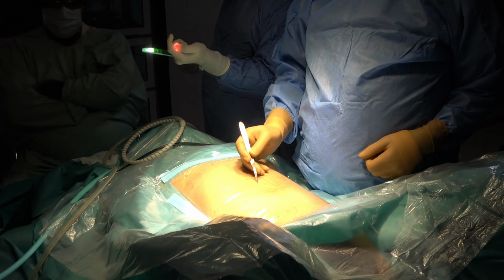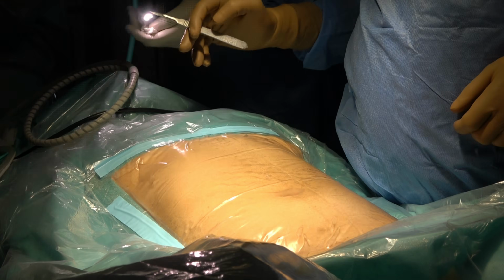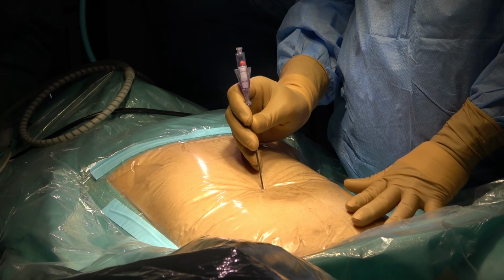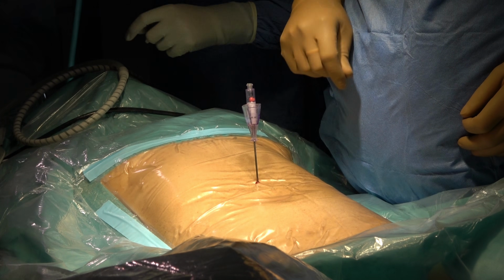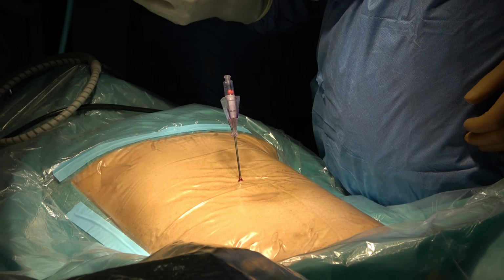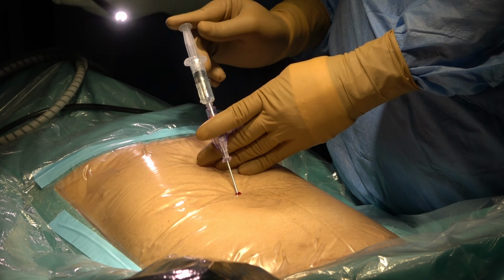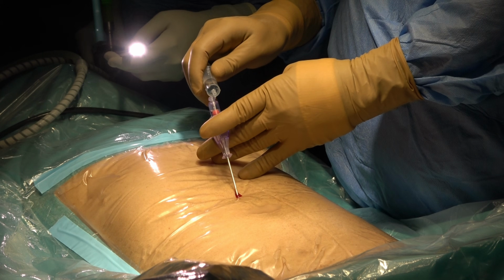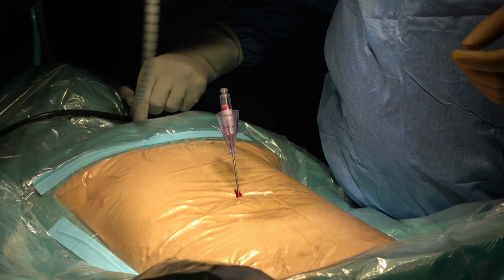Hello friends, this is a case of diagnostic laparoscopy, hysteroscopic submucous myomectomy and tubal patency test of a patient who has an approximately 2.5 centimeter grade 0 submucous myoma. So we are doing the suction irrigation and hanging drop test, and we can see that this hanging drop is positive, and now we will start insufflating the abdomen.